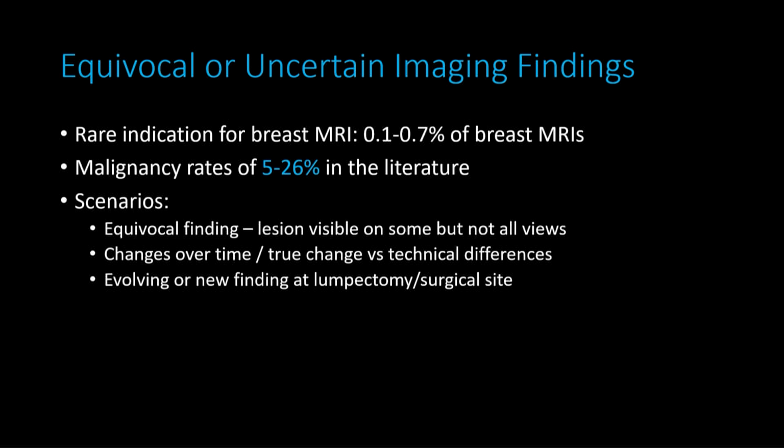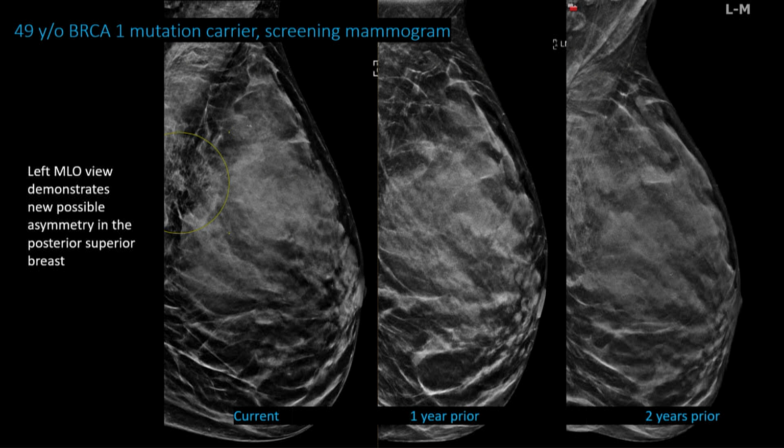Is it a change, a true change, versus technical differences on mammo and ultrasound? And finally, as we've talked about a little bit already, is it a new finding at the lumpectomy and surgical site?